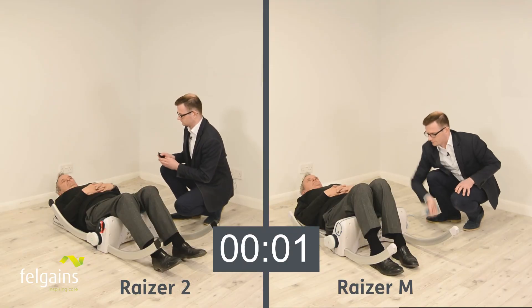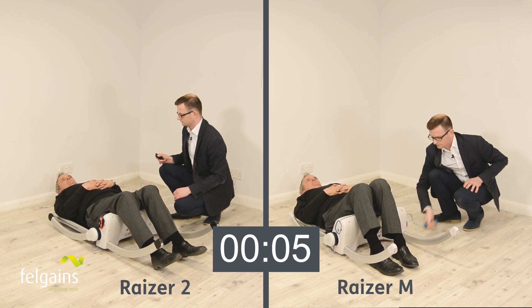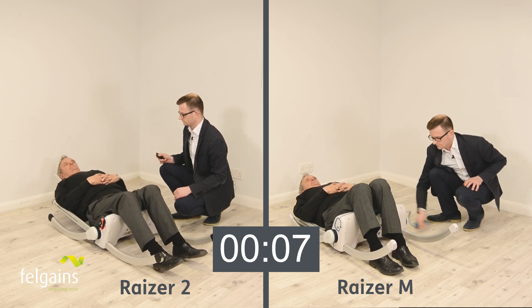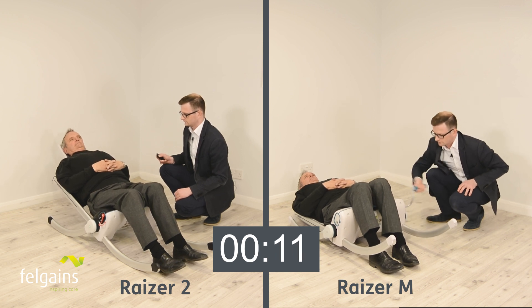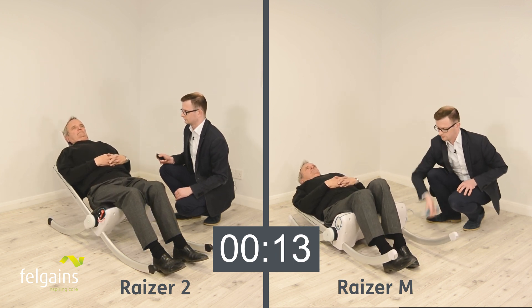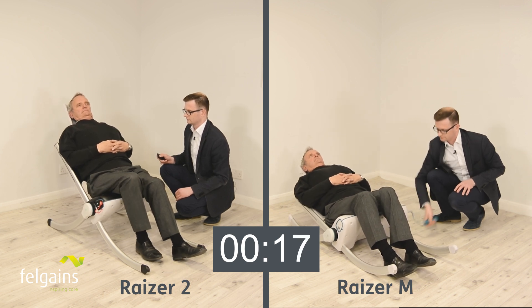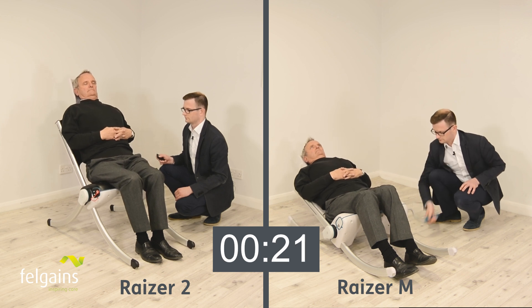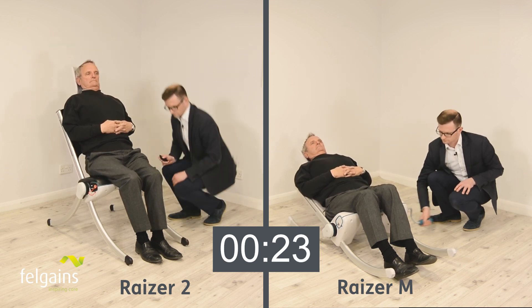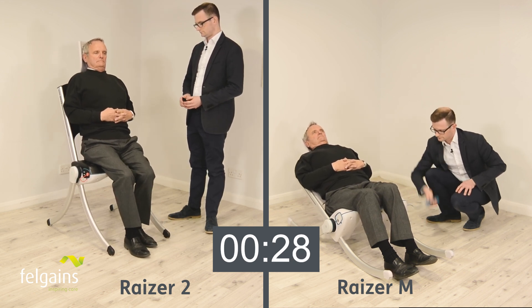To show you the difference in lifting time, here is a side-by-side comparison. The Razer 2 takes just 30 seconds to lift a fallen person. This makes it ideal for busy health and care professionals such as ambulance trusts and telecare providers who need to make best use of their resources — the faster the response, the more people their workforce can help.